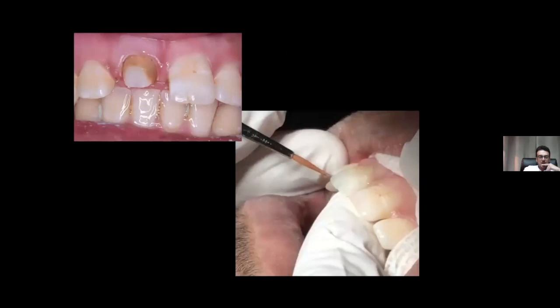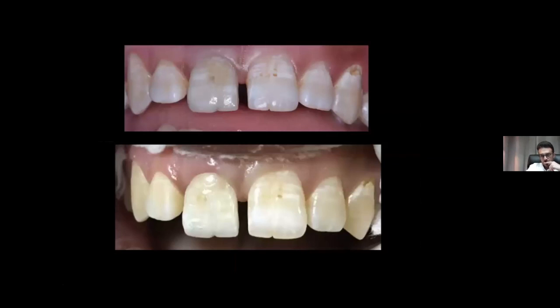After making the preparation, post and core, actually here we have another challenge, that is discoloration of the stump. So this is where we use a different type of ingot of the lithium disilicate material, just to make sure that this discoloration will not show through the crown. And then we go with the same steps and procedure, color mapping and intraoral staining and shading. Okay, and this is the final result.